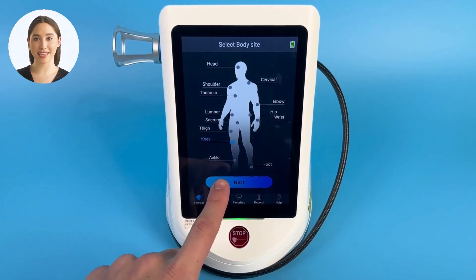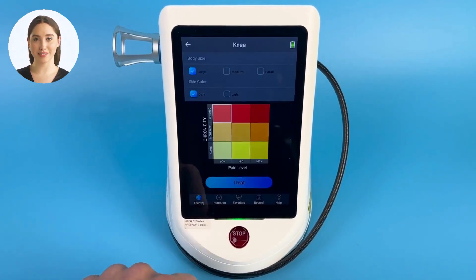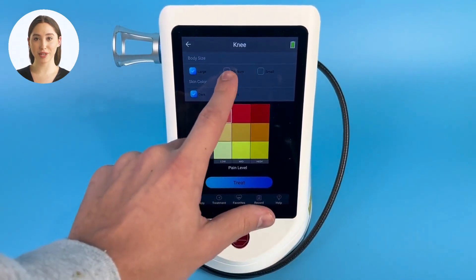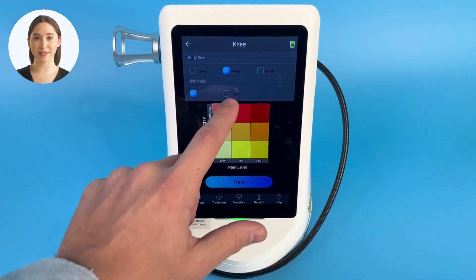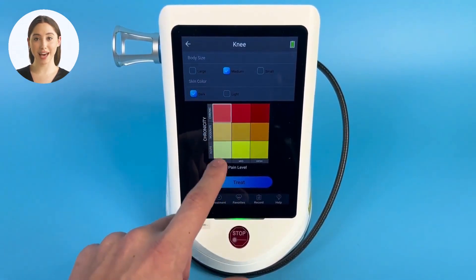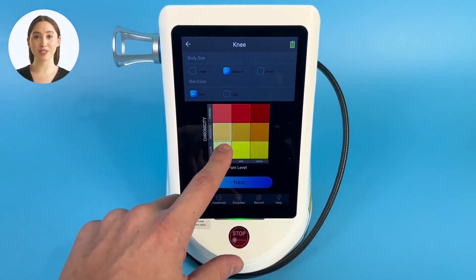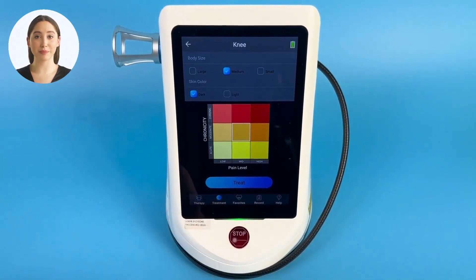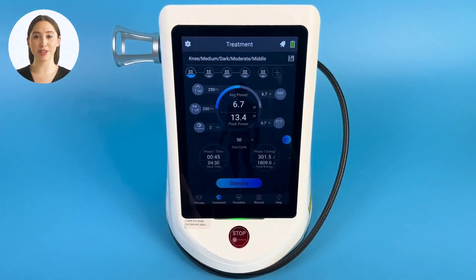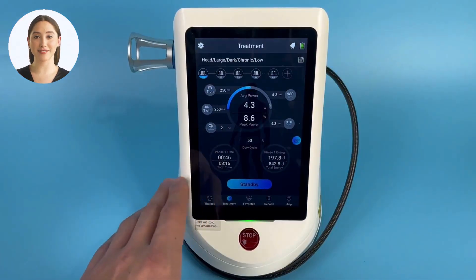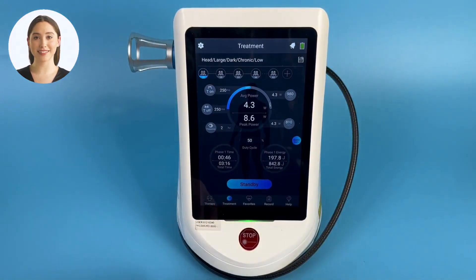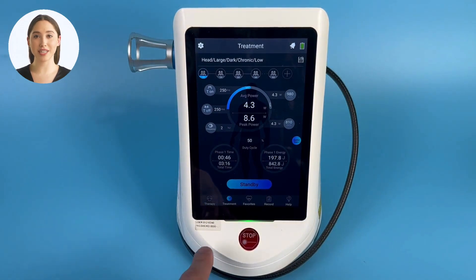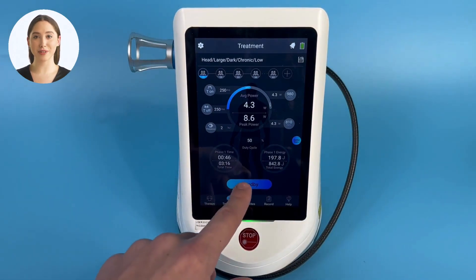The next screen we are taken to is the treatment site. Select the desired treatment area and click next. After this, we select the patient's body size and skin color to have the laser adjust its treatment around the presets. Last, select the pain level and chronicity and click treat.